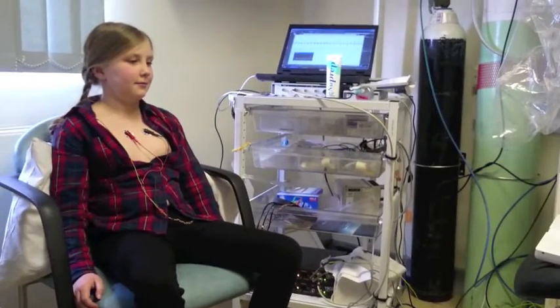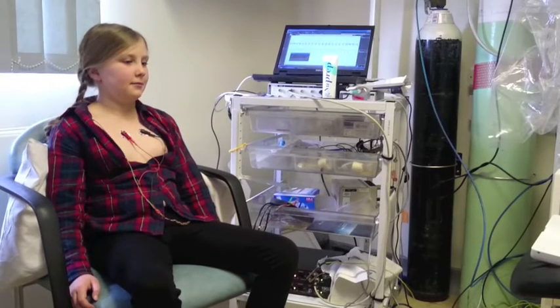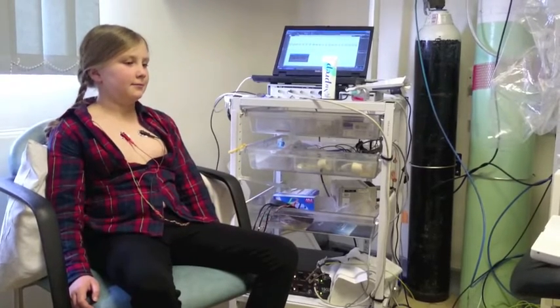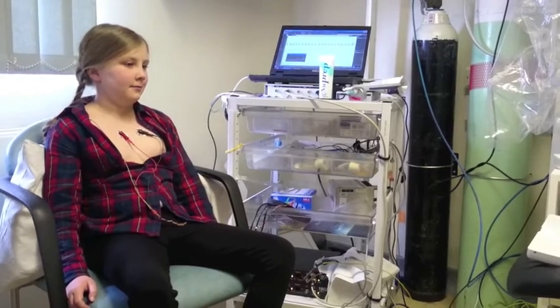Ellen has stickers on her chest to measure her breathing muscles. She has to sit still and breathe normally in and out. This test is very easy. You can watch a film while the computer measures your breathing. It only takes five minutes.